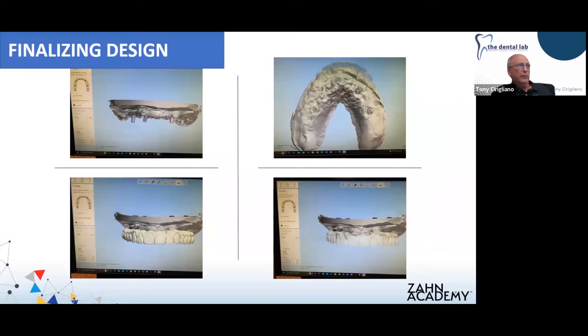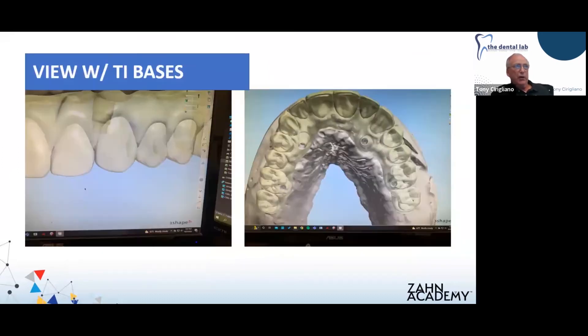Here is our scan of the model with tie bases in place. You can see there's going to be a little bit of path of insertion issue that we will address later on. You can see the final design of our case — it has full gingiva on it. The overjet on this particular case is well off the ridge. It's not the most ideal situation, but we're all presented with cases like this from time to time. We're going to recommend that a water pick be used for this patient, as there's definitely going to be some issues with keeping it clean.